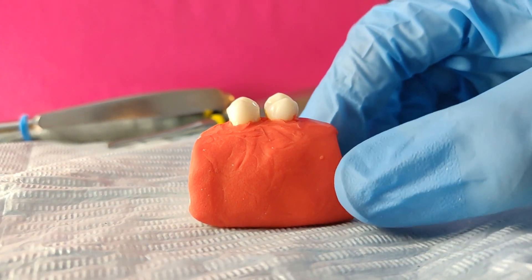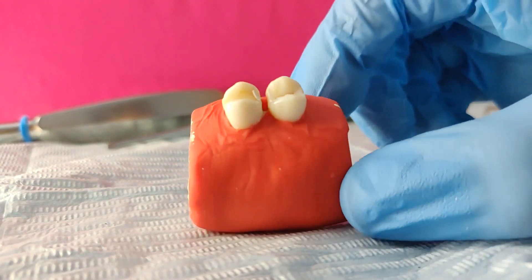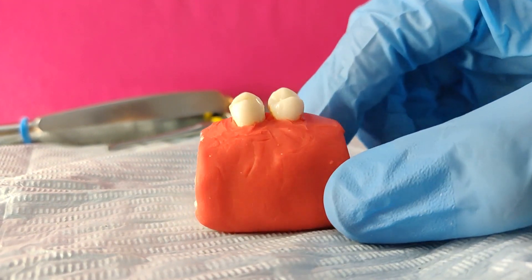And this red dough resembles the gingiva or the mucosa which cover the underlying alveolar bone.